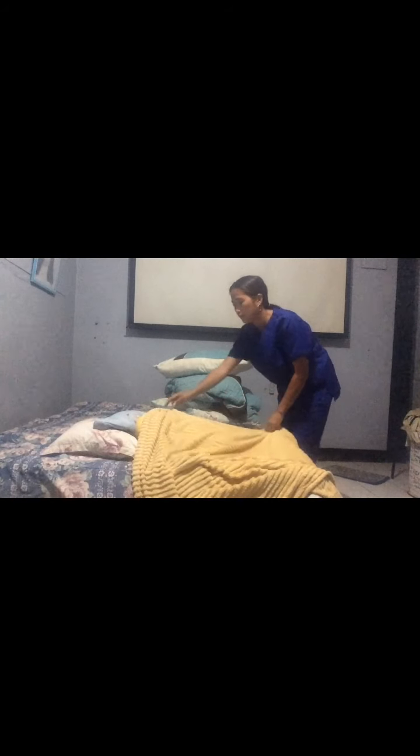Identify the client, check to see if permission is required. Explain the procedure to the client. Provide for privacy.